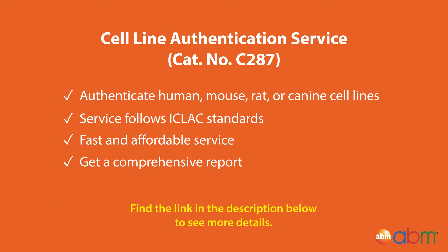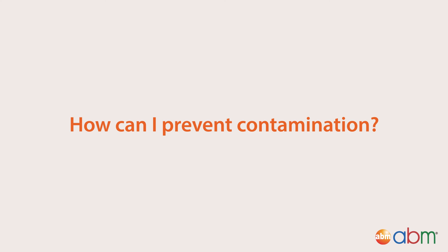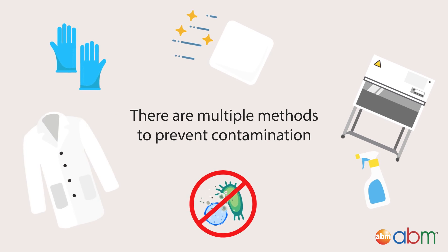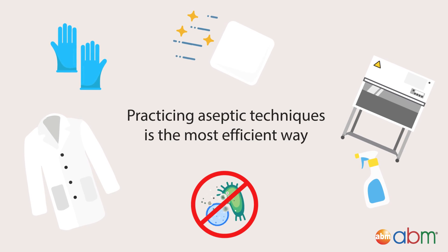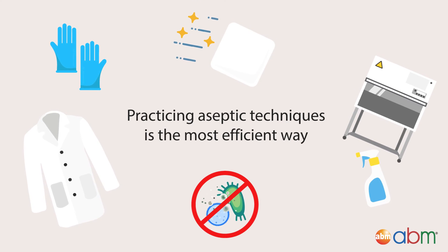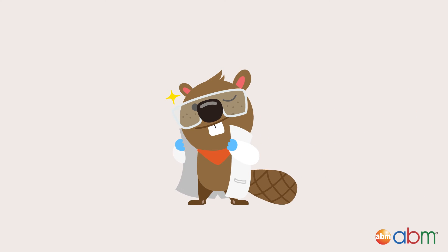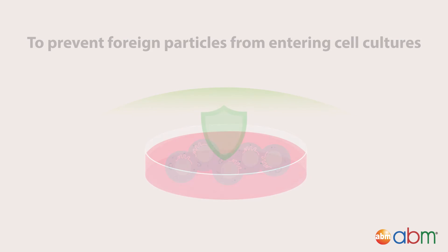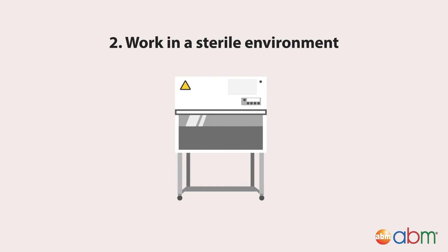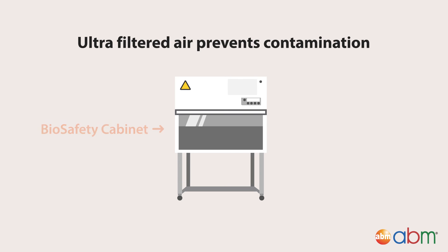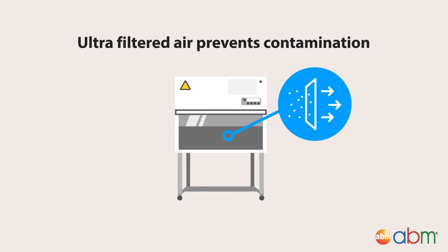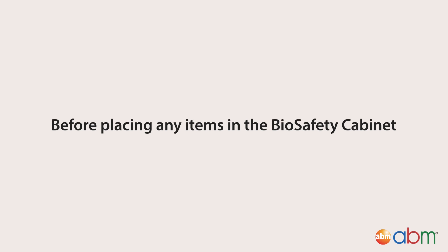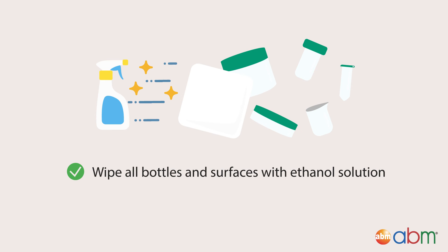ABM offers comprehensive STR profiling to help you ensure you are working with the correct cell line. With all this talk about contamination, there are actually multiple methods that scientists can utilize to prevent contamination from occurring in the first place. Practicing aseptic techniques in the lab is one of the most efficient ways of preventing contamination. Examples include wearing proper PPE so that foreign particles on your skin or clothes will not make it into the cell culture plate. It is also important to work in a sterile environment like a biosafety cabinet, which is a laminar flow unit that contains ultra-filtered air that prevents foreign substances from entering the work environment. Before placing any items in the biosafety cabinet, it is essential to wipe all bottles and surfaces with an ethanol solution to effectively eliminate any microbes.